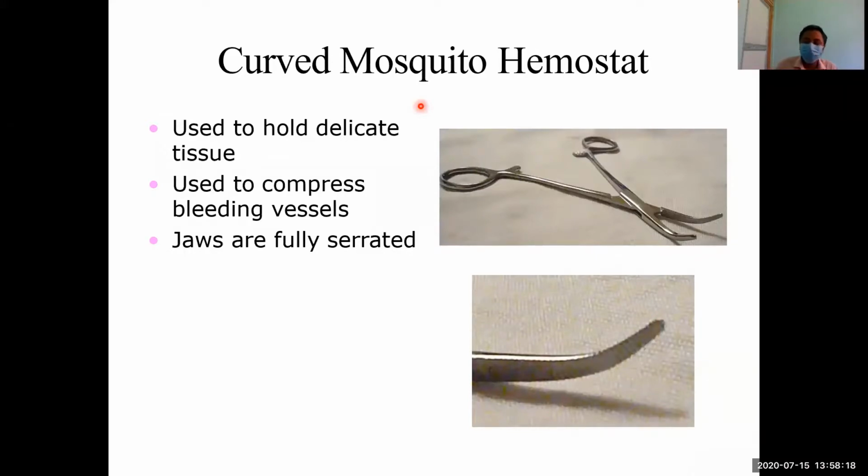Then, what are the uses of hemostatic forceps? The basic use, the number one use, is to achieve hemostasis. As soon as we proceed with a surgery and reach below the dermis, there will be bleeders, like bleeding vessels. We will see blood vessels that are oozing or bleeding. So we will catch those with these hemostatic forceps and we will secure hemostasis.